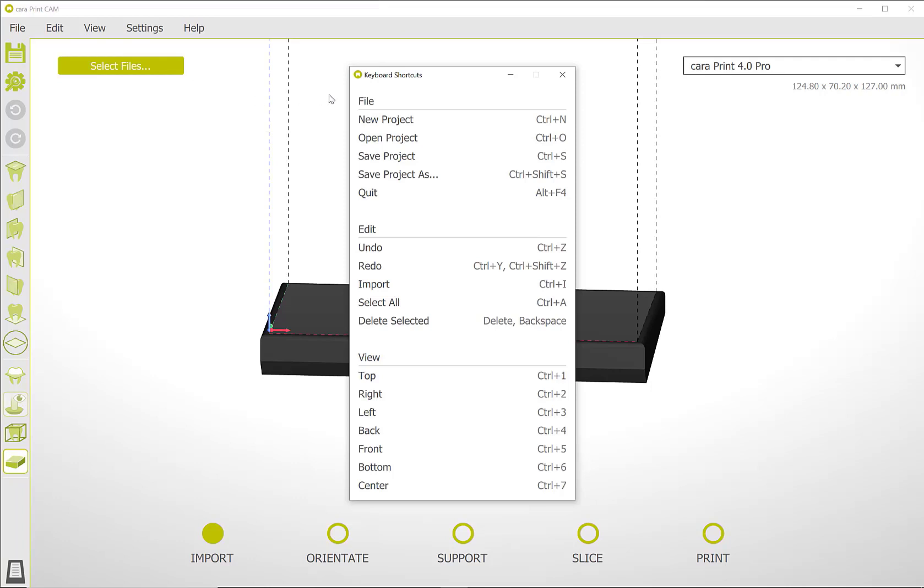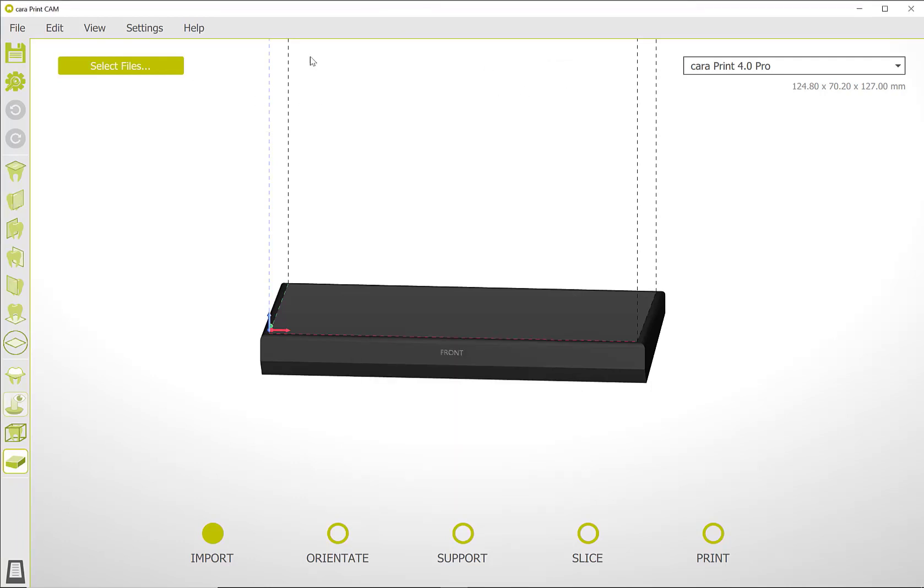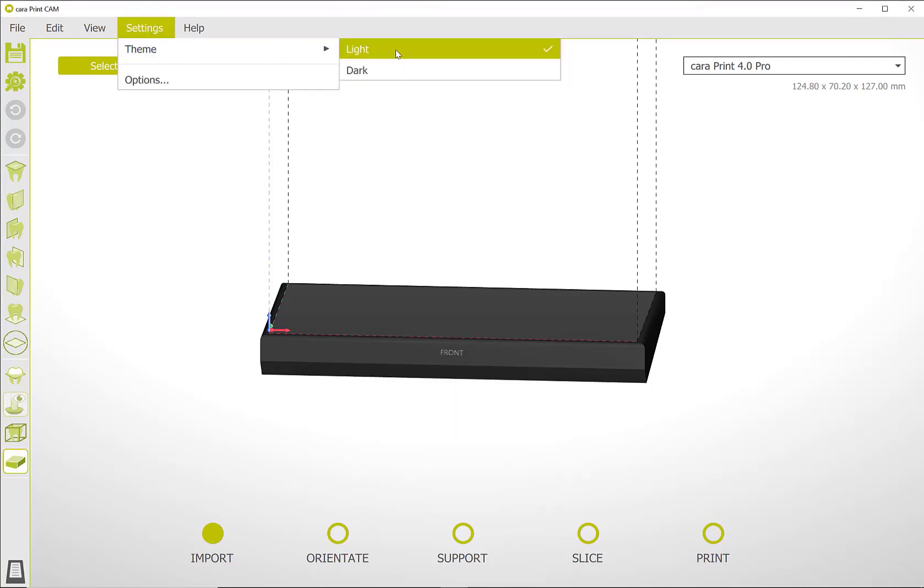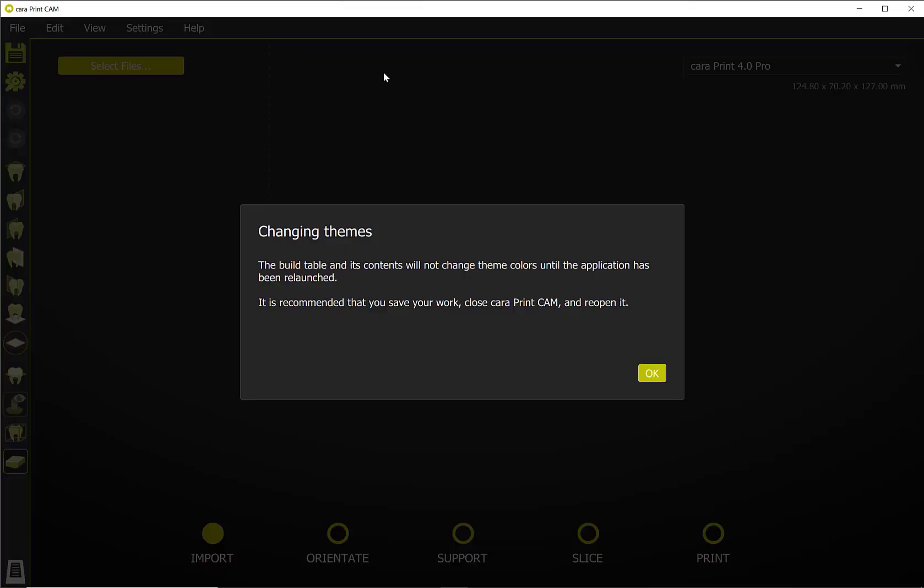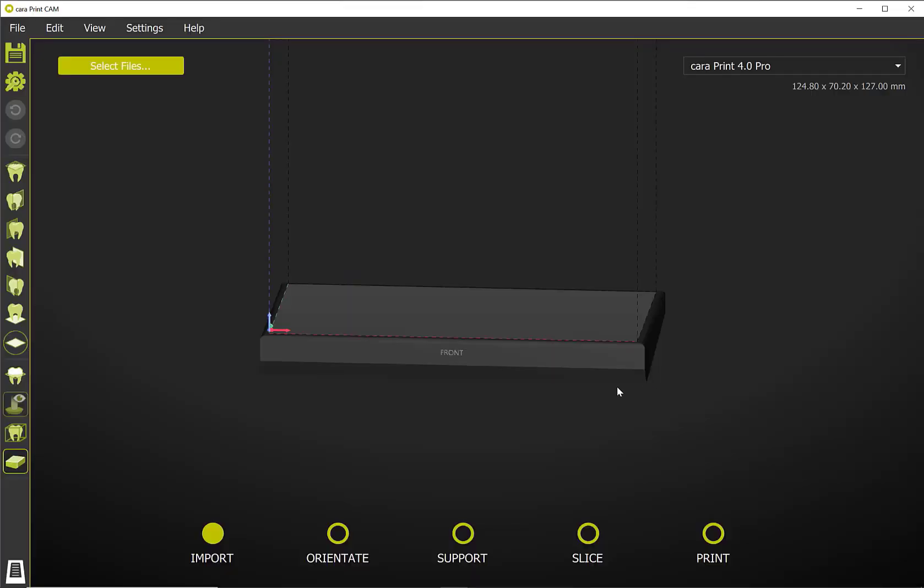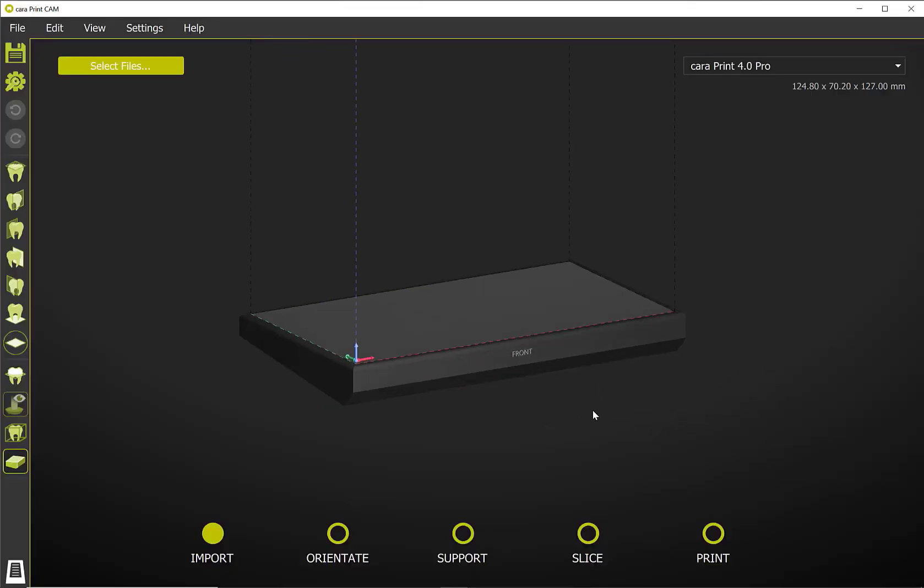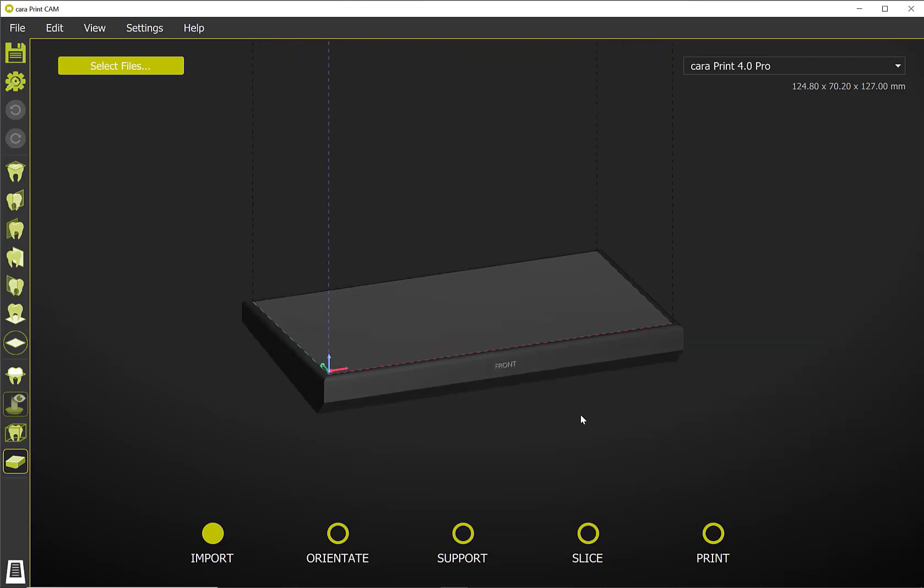Under the Settings tab, you can choose between two different background colors. Depending on the material, it may be useful to change this. Please confirm your change with OK.